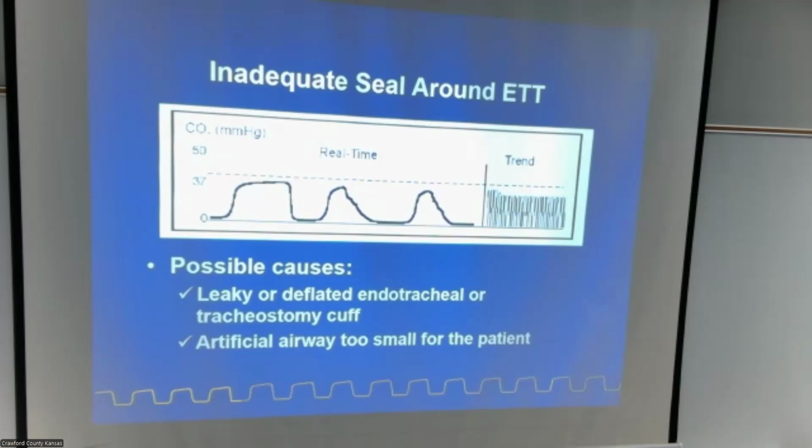They do capnography off LMAs, which I don't know how they calculate that dead space, but that's one way your anesthesiologist tells if the LMA is a good fit for surgery, whether they get a seal or not. Because they get this if they don't have a good seal, so they'll change out your LMA or they'll try to inflate more air in.